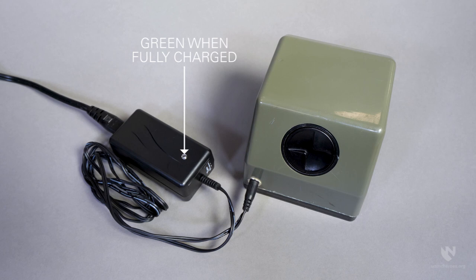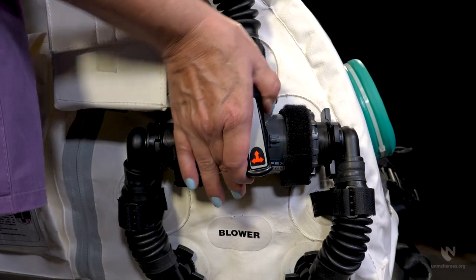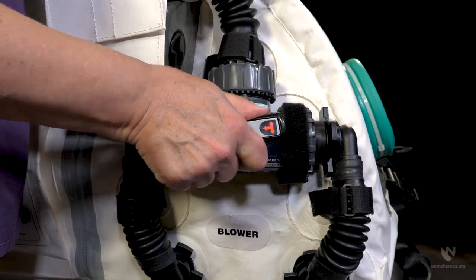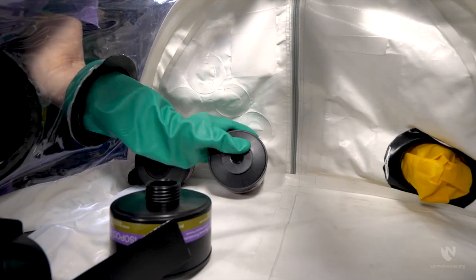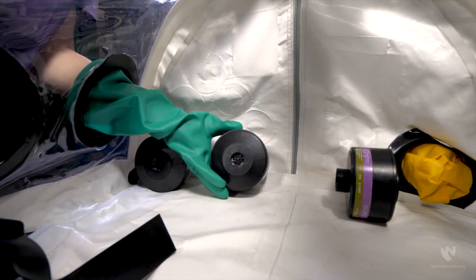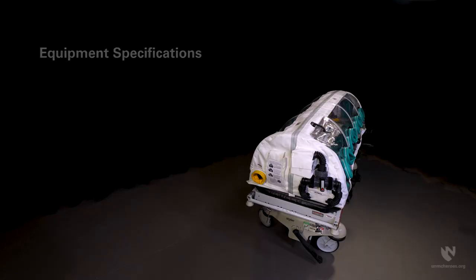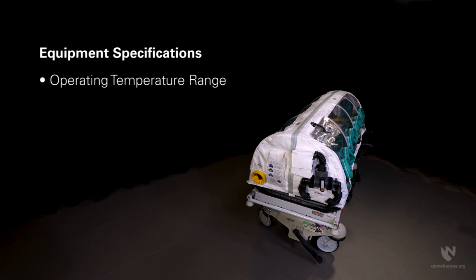A green indicator light will show when the battery is fully charged. Consider placing a label with the last charge date directly on the blower motor. In the event it becomes necessary, the system was developed to allow the user to safely change filters during transit and still maintain negative pressure — this is referred to as a hot swap and is covered in our assembly and operation video. Finally, the ChemBio isopod has the capability to operate in ambient temperatures between minus 4°F and 120°F.